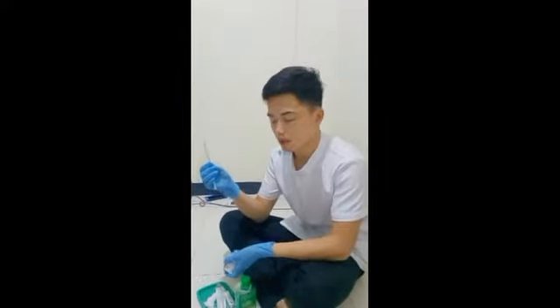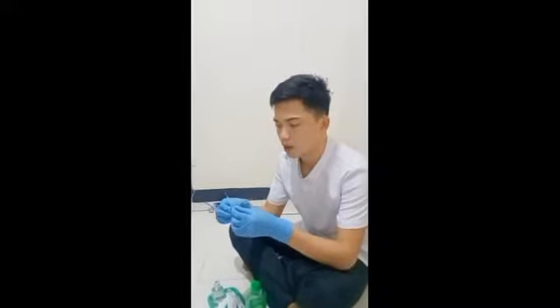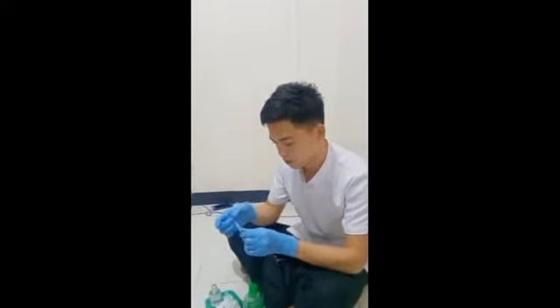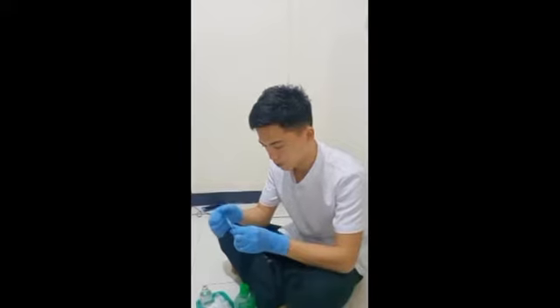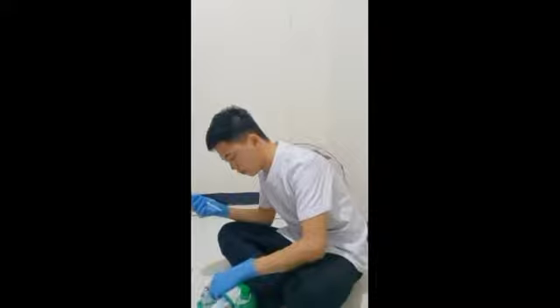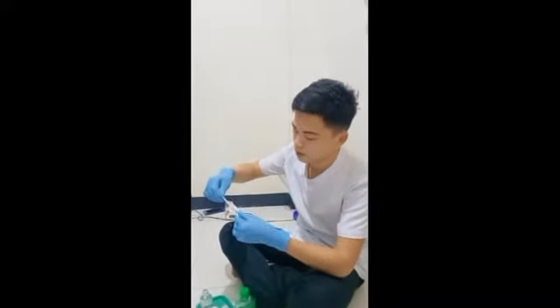During this aspiration or dilution, it is 0.9 for the sterile water and 0.1 for the medication, and put again the sterile water in the syringe.